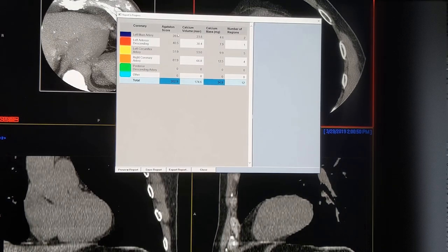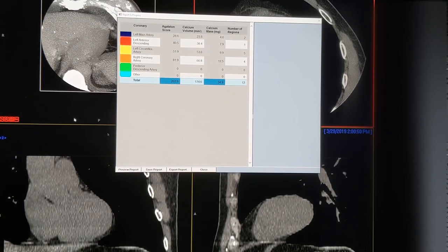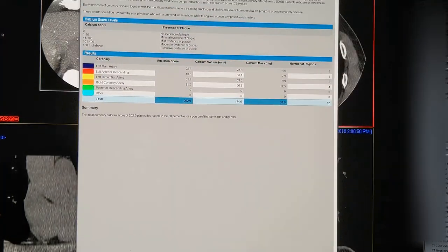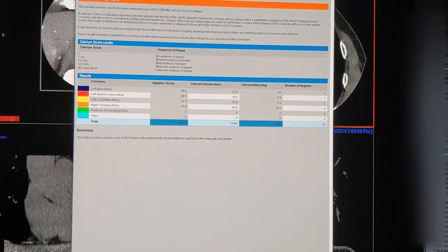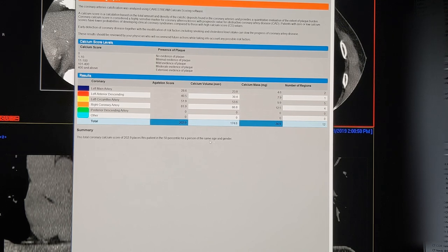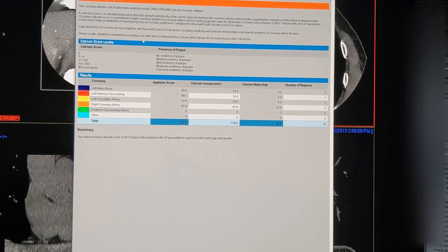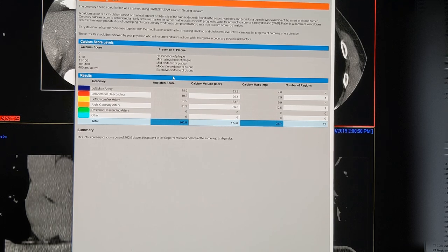I'm going to check the preview on this report. Here's what we have — you can see the values of the total calcium. This gives a total calcium score of 202.9 for that patient, with a risk at the 50th percentile for the patient's same age and gender, if those statistics are available. That's how we're doing it for all of you out there getting a coronary calcium score. Hope you enjoyed it — thanks, bye.